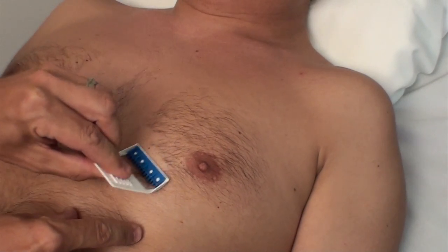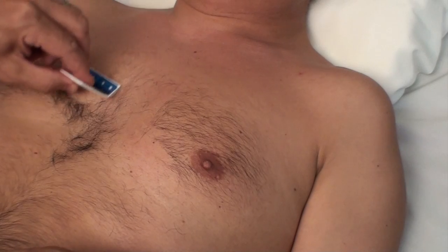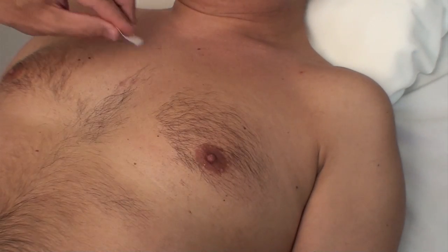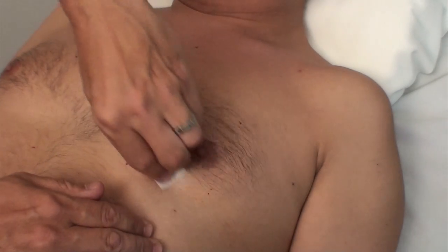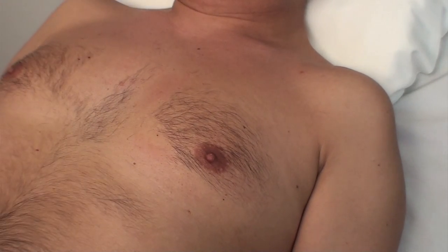First, if there is any hair on the electrode skin areas, shave it to provide better electrode contact and help reduce painful removal of the electrodes. Clean the skin area with either alcohol or soap and water to remove skin oils. Please note that if the patient has sensitive skin, it is usually better to use soap and water to minimise skin irritation. After cleaning, let the skin dry thoroughly.